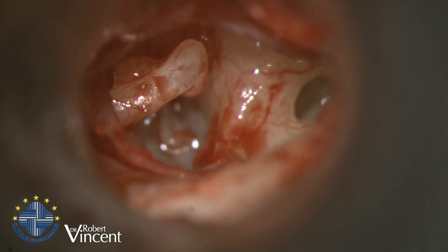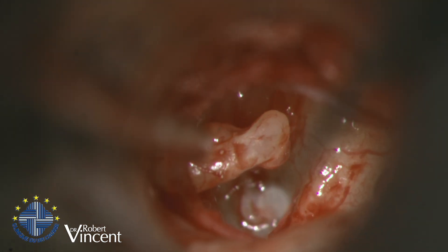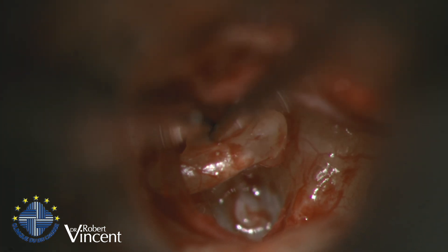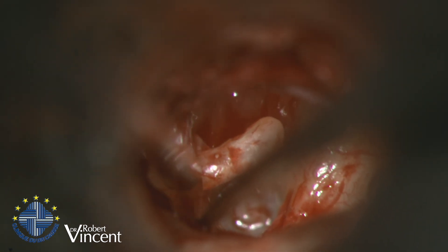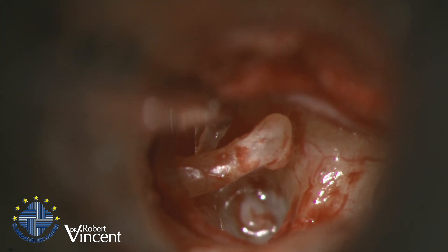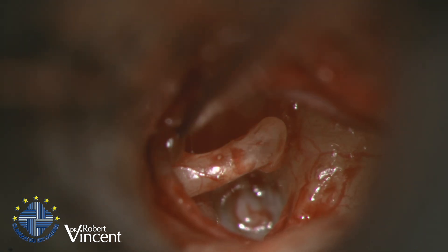There's just some mucosa here — sometimes if I can remove it, it's always better, but it's not always possible. This is thicker tissue and might create a problem to place the loop safely around the incus. I pushed it upwards and now it's not going to create any problem because it's far away from the mid surface of the incus. Since it's too thick to remove, I will leave it and now proceed to perform the fenestra.